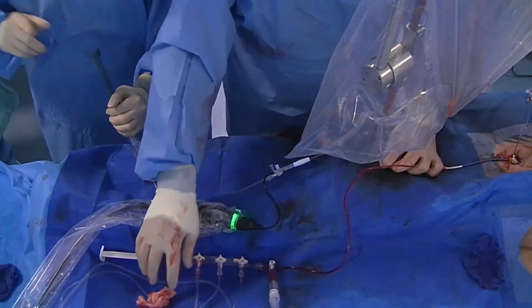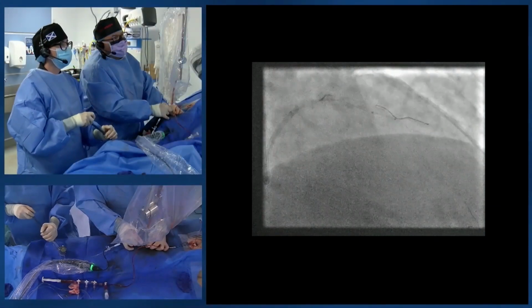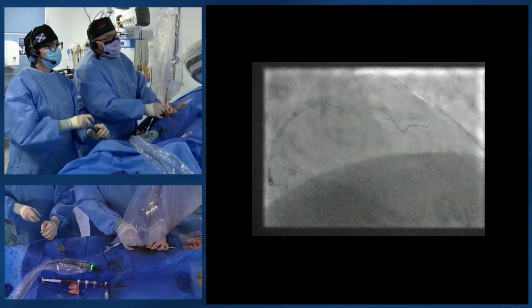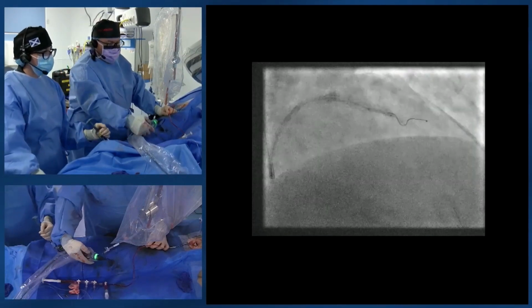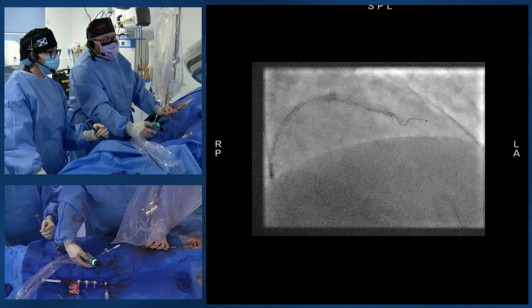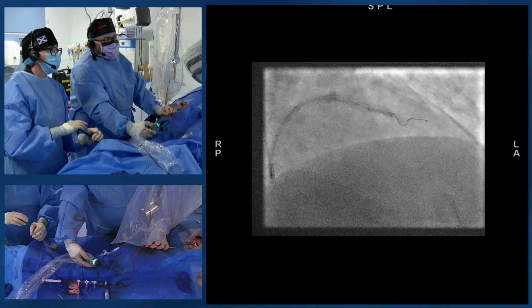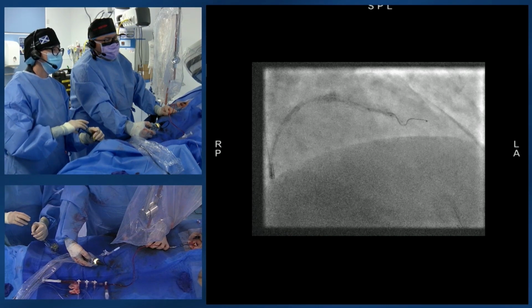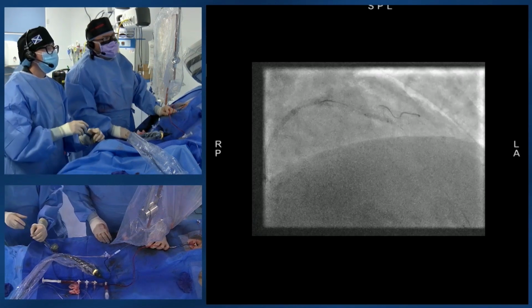It looked to me like the distal end of the balloon was up, but the proximal half wasn't. So if we keep it back a marker or two, just to center that. Slightly, yeah. Good. So 4 atmospheres again. Again, I'm pressing the button on the shockwave device. Sometimes if you look at the physiology, you get shock topics, and you see we've had a couple there. 6 atmospheres. Okay, and then let's look at that again, Stuart. Down, store that, thanks.